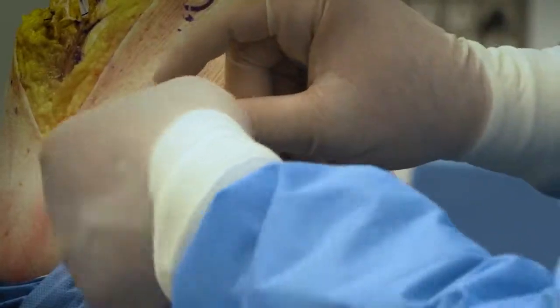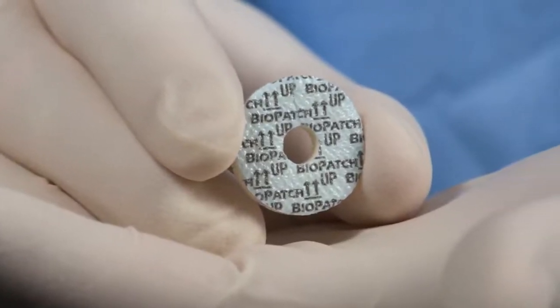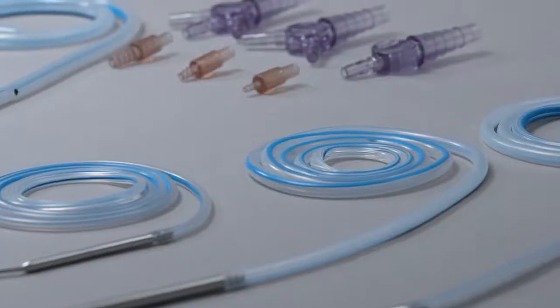The use of the Biopatch around drain sites has reduced the awkwardness of dealing with drains, both in terms of applying the dressing and the patient's care afterward. It's made drain care more automated and more consistent.